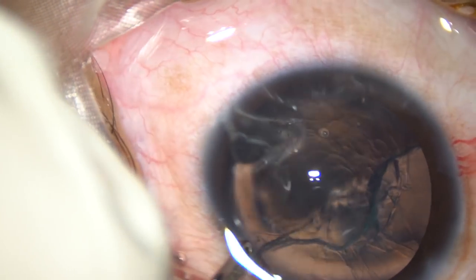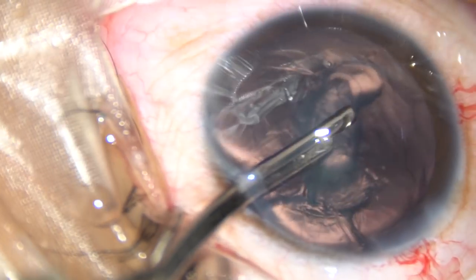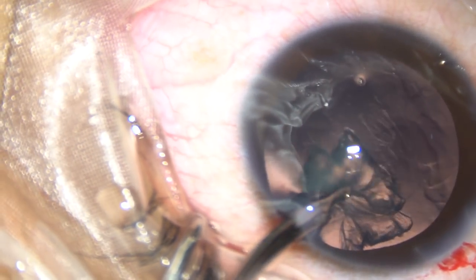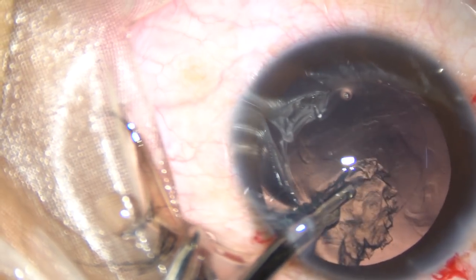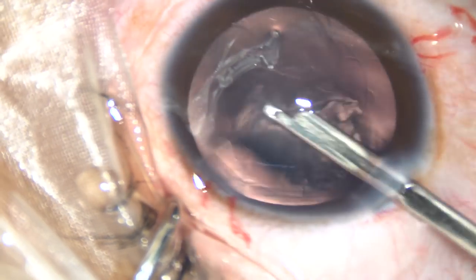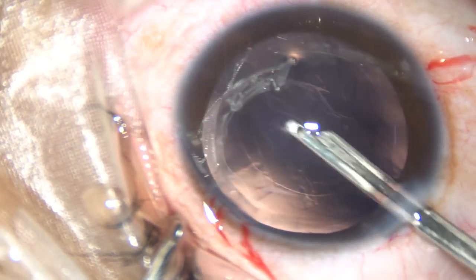We didn't do a complete hydrodissection, because if we do hydrodissection the whole lens tends to come into the anterior chamber, and there is a lot of stress at the rhexis margin. Sometimes, in one case, the rhexis margin gave away. It can be easily removed in this way. I am using a 23-gauge Simcoe. You can use a bi-manual if you don't like this instrument.